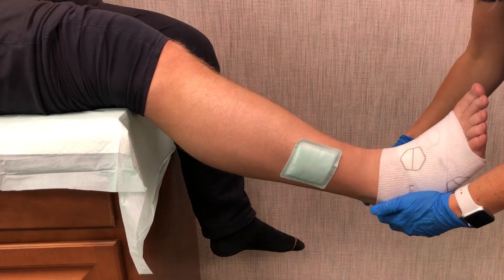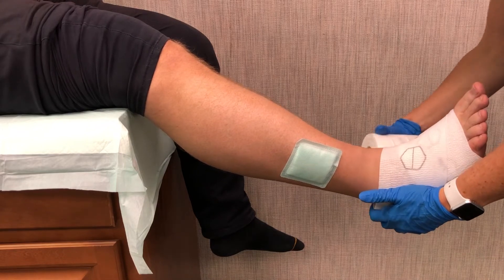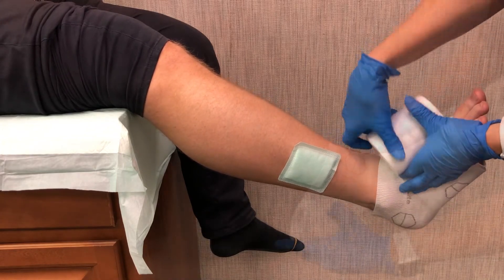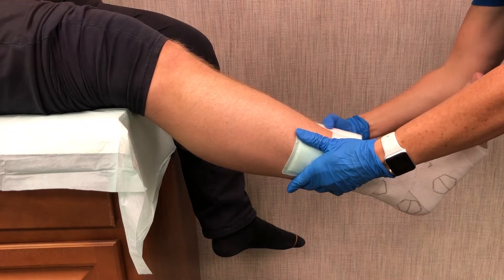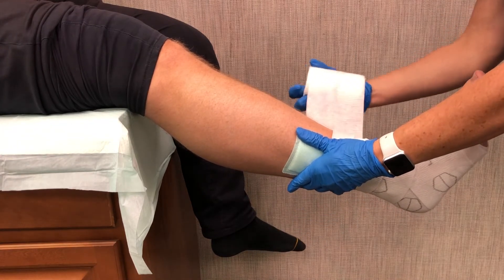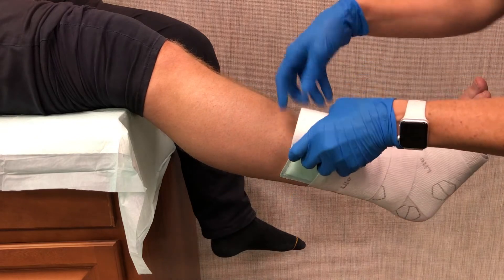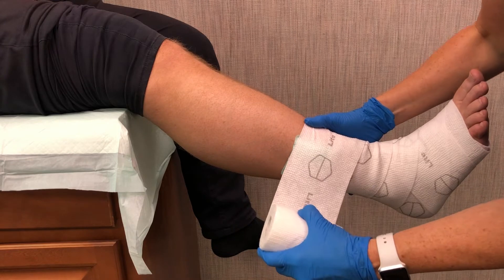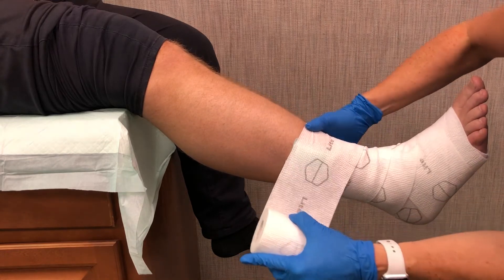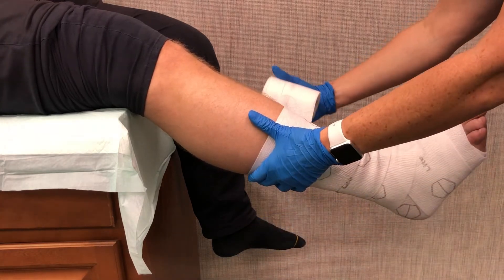After 2 turns for fixation, wrap the bandage across the back of the foot and include the heel using a figure 8. Wrap the foot by pressing adequately while considering the anatomical, non-cylindrical shape of the foot. Wrap the lower leg with the padding bandage using a spiral technique following the indicator for optimal stretch. In order to reach the optimum level of compression, stretch the bandage until the indicator has reached a regular hexagon.